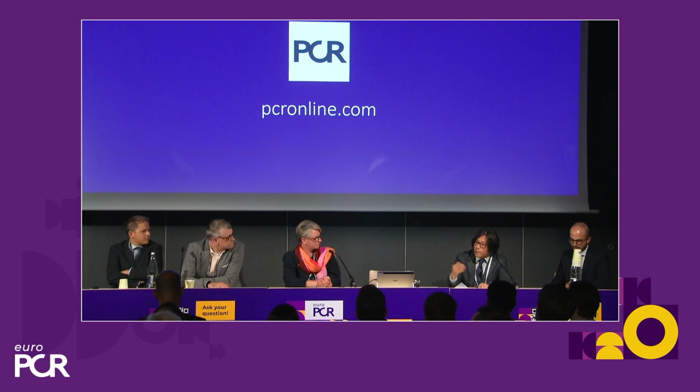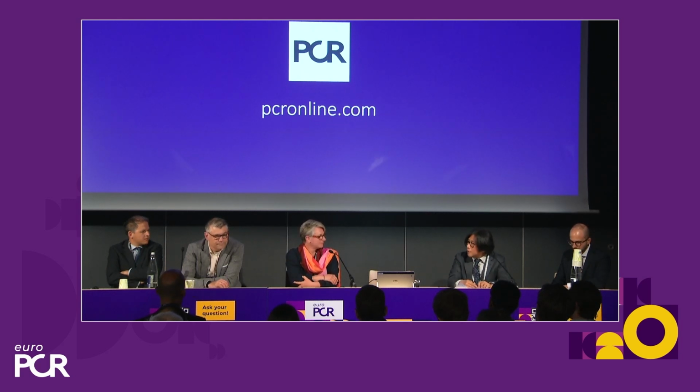Although when we compared that in one of our studies, we could not see statistical significance between these 5, 6 software. However, I think there was some difference between these software, and especially some software used only one view, and some software use 2 views. And I think acquisition is really the key for the performance of this type of software.